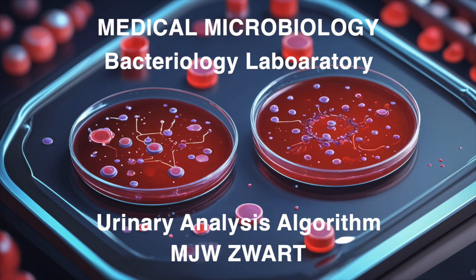Interesting. I'm curious, have you ever used this Q-score method in your lab? I haven't used it personally, but the concept is brilliant. It's all about efficiency, making sure you're focusing your resources where they matter most. The Q-score helps you quickly differentiate between contamination from skin flora and a true urinary tract infection. So it's like a triage system for urine samples. Exactly.